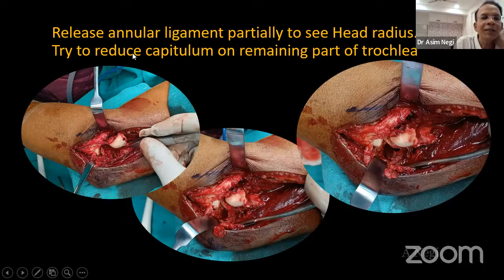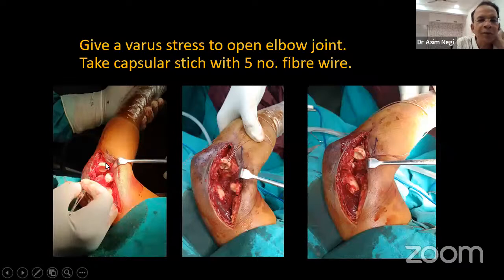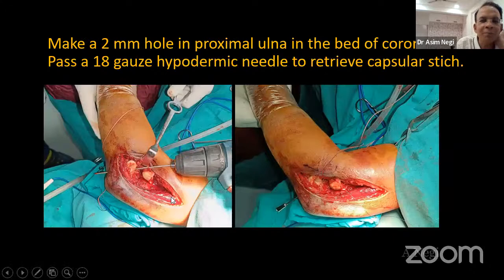And then you try to reduce the capitulum on the remaining part of the trochlea and the posterior part. Here, you give a varus stress to open up the elbow joint, and then take a capsular stitch with number 5 fiber wire. So you make a Krackow stitch in the whole lateral ligament complex, which we had seen.